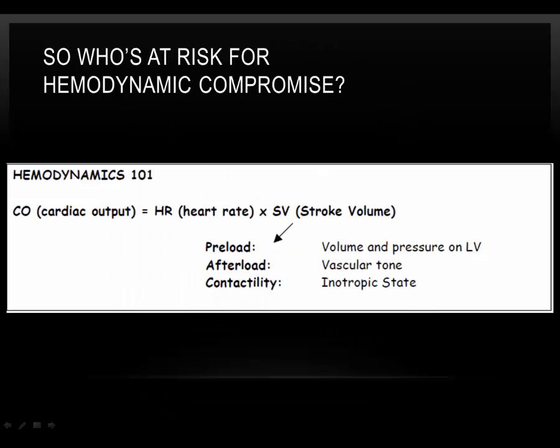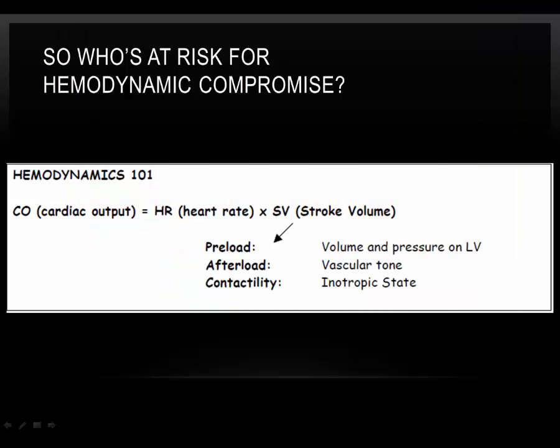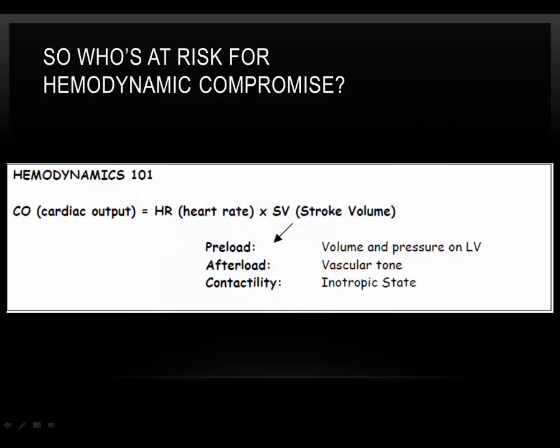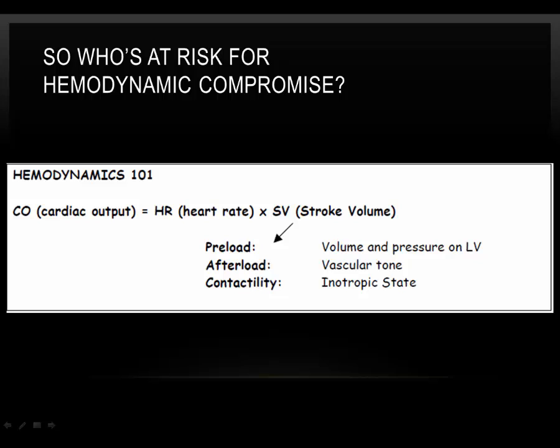If the QRS duration is greater than 120 milliseconds, or 3 little boxes, then at least a bundle branch block exists. The ventricles, being out of sync, have reduced preload. If the QRS is greater than 120 milliseconds, then the ejection fraction is 50% at the most. Ejection fraction is the volume percent of the blood the heart can pump out. Healthy people at rest and awake have an ejection fraction between 60 and 75%. This results from the reduced contractility because it takes so much time to depolarize. The contraction is also slow and weak.